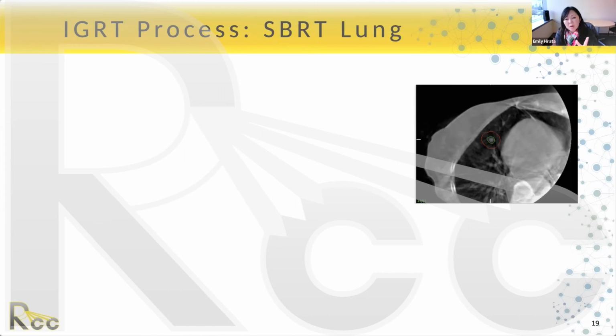So it'll say, okay, you've got like a 0.5 degree roll that you need to apply. You can go in and basically set those to 0 so that you're only doing translational positions or shifts. And that's what you want the physician and physicist to review, because if your system is not able to automatically apply any roll, pitch, or yaw adjustments, you don't want to do that manually. Good.